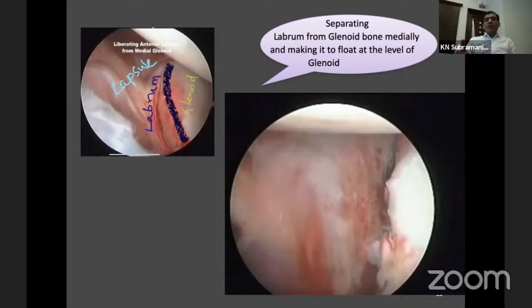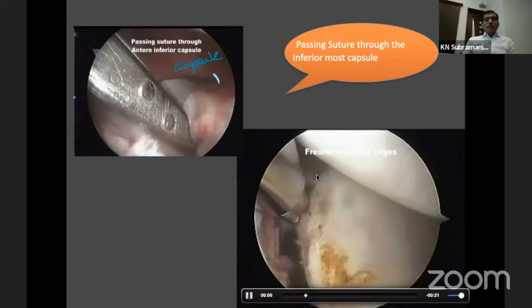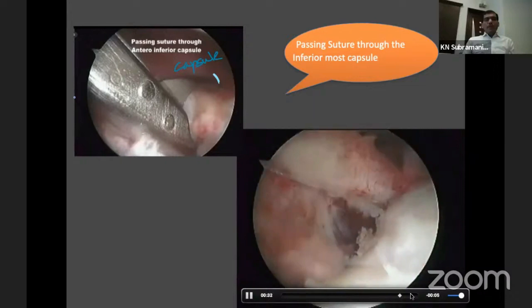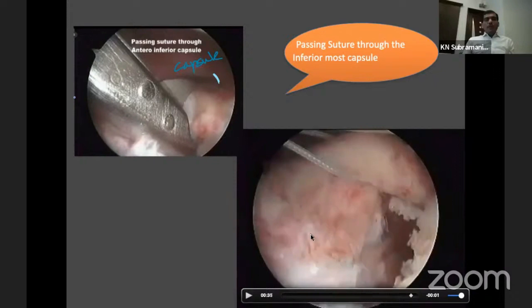This displaced labrum is essentially a non-union, and that is why people are having recurrent dislocation. The next step is to freshen the bony margins. To freshen the bony margins you can use a liberator, a rasp, or a burr. Then use a suture-passing device. You should take tissue almost up to the 6 o'clock position, pass suture through the anterior capsule, and try to pull the inferior capsule to re-establish its tension. This is a very important step — once done appropriately, you will see the head of the humerus come to the centre of the glenoid. This is the tensioning procedure.